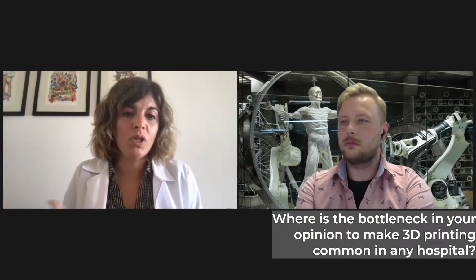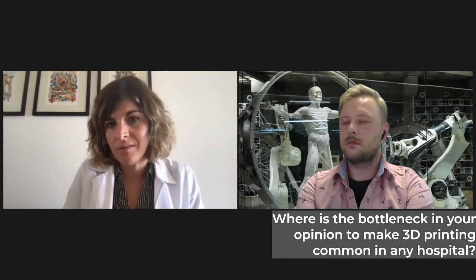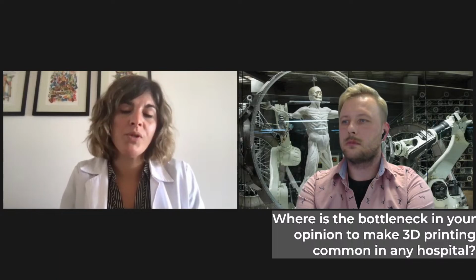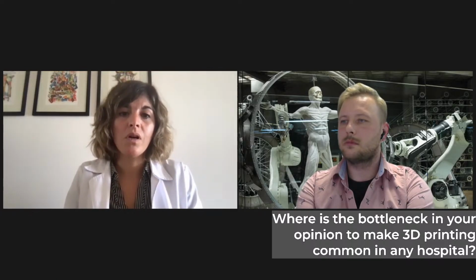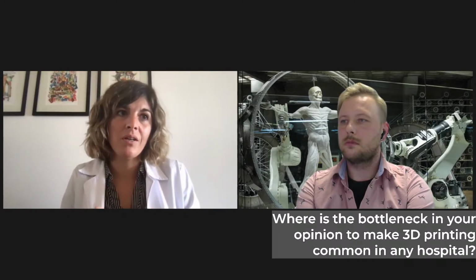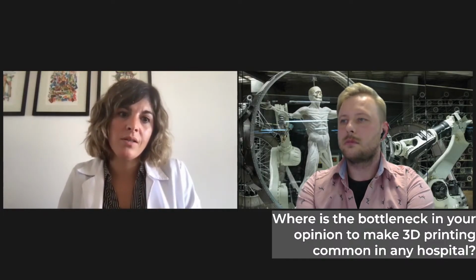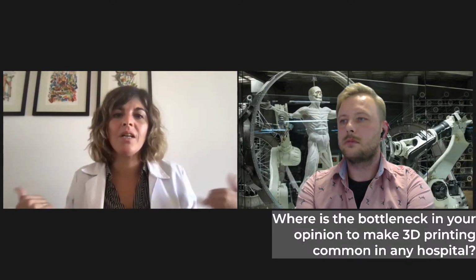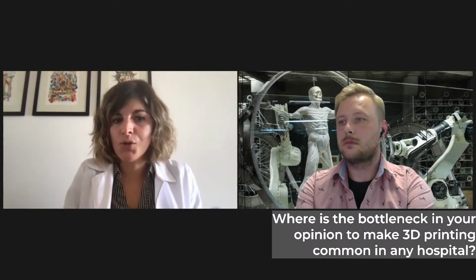ship whatever you need as 3D printed from other hospitals. So there's no need to have inside your hospital a 3D printer or human resources that are prepared for that, because this can be done remotely. So even if that's a bottleneck, because some hospitals think they need to have prepared human resources or hardware on site, it's easy to overcome because we can work remotely and we can ship whatever people and surgeons need to prepare the surgery.